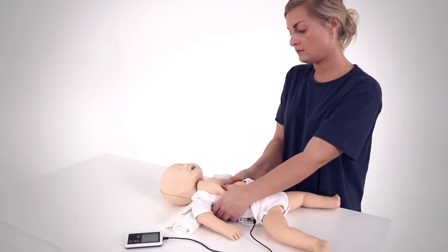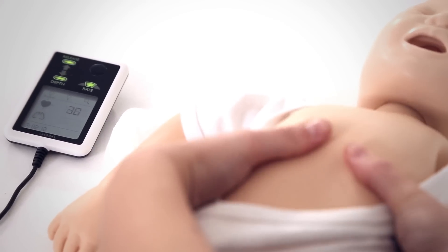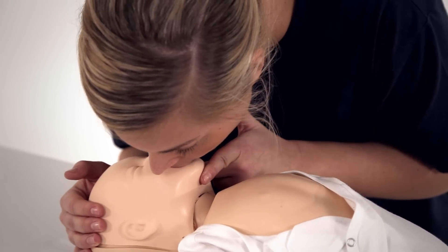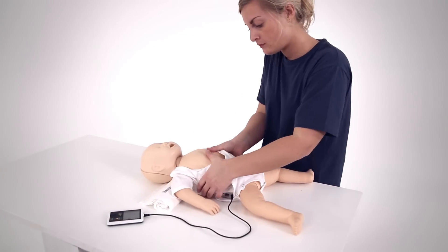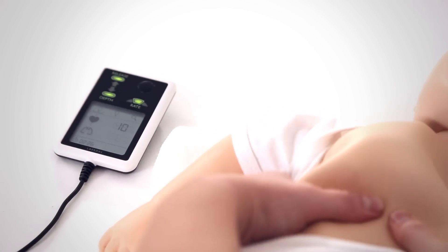Reisussi Baby can be connected to Skill Guide for immediate feedback during CPR training. A summary screen can be viewed after the session is completed. This provides feedback on the key elements of quality CPR and helps students improve.